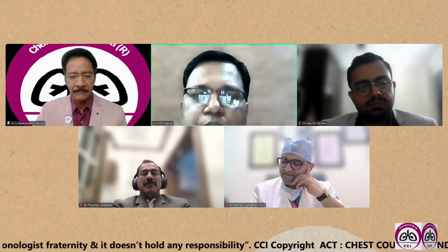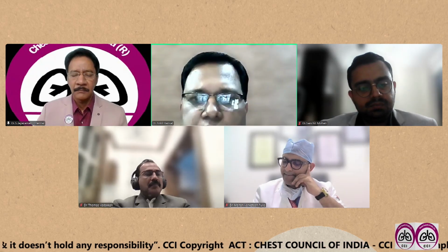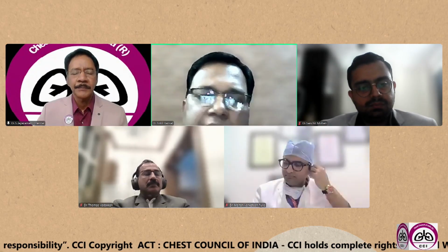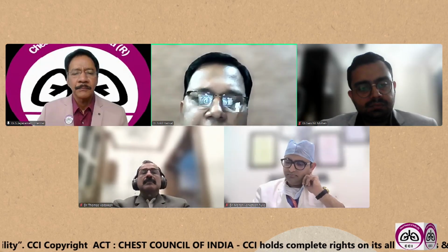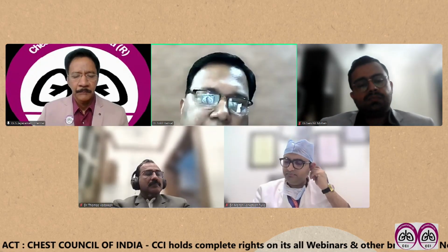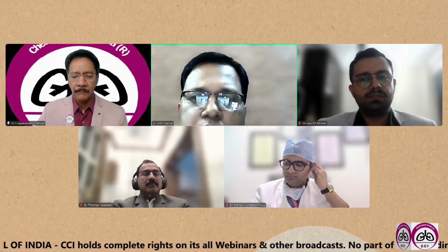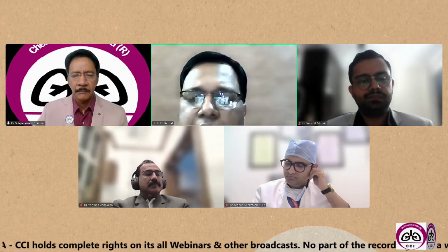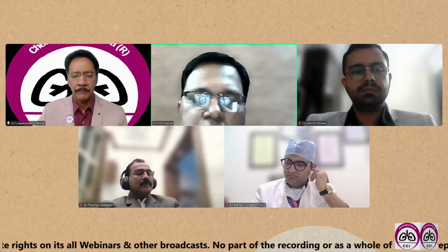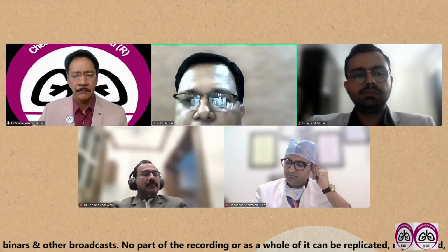As we know, CT is a very important tool before we start an EBUS, so we should have a complete look at the CT before starting. One particular slice, the carinal level, is very important for predicting the anatomy, the staging, and the safety coverage. Why is it important? Because at the level of station 7 we expect the carina, where the trachea divides into the right and left main bronchus. So we can see the orientation of both bronchi there. We can see the pulmonary artery bifurcation.